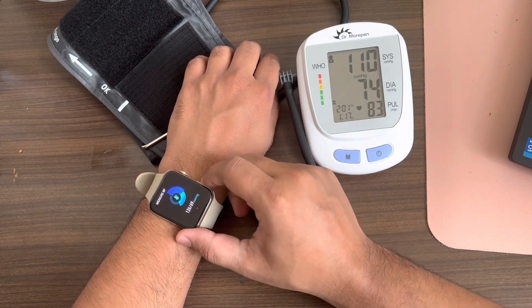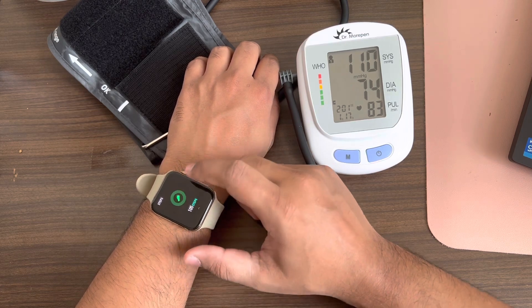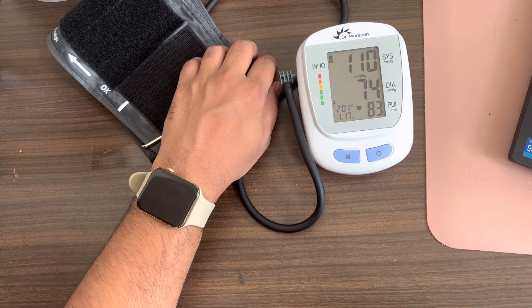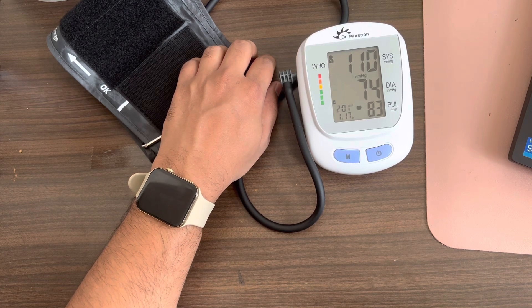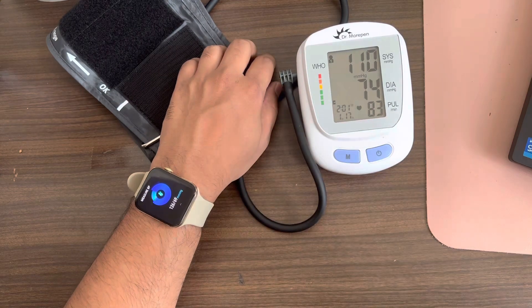The smartwatch is not as accurate as the dedicated BP monitor, but you can use it on a regular basis to see if your BP is going very high or not. That's about it guys, hope it was useful. Let me know your view in the comments — whether we should rely on the smartwatch BP or any other measurements it shows.